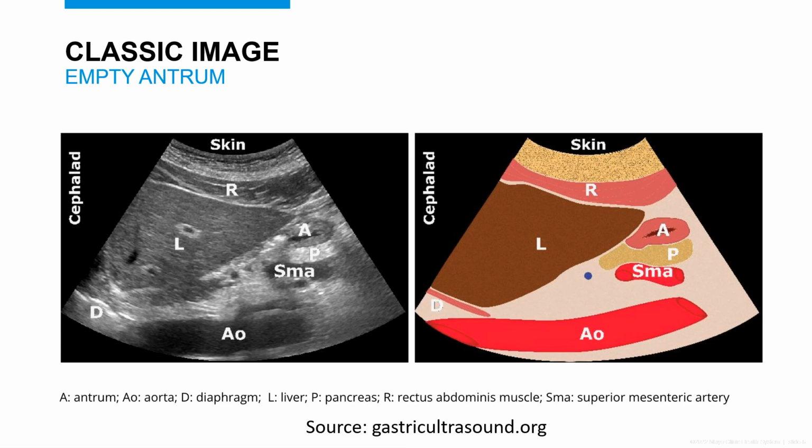We know we are at the antrum when you see the stomach, the pancreas, the SMA, and the aorta all in the same image. You may have to slide your probe parasagittally to get the alignment of these structures in the same frame. It is imperative that you prevent having an oblique cut of the antrum by keeping your probe perpendicular to the surface of the skin. Now that we have verified we are at the antrum, we can assess the appearance of the gastric antrum.